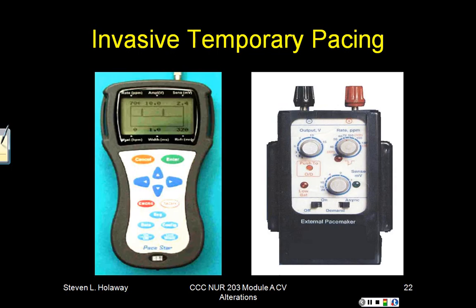So one of the big problems with temporary pacing, whether it be transvenous, as we're talking about here, or epicardial, which we'll talk about with our bypass patients, is that microshock can be an issue. You have to insulate these wires to prevent microshock. Your book will talk about putting a rubber glove, or fingers of these rubber latex gloves, over these wires to prevent that microshock effect.